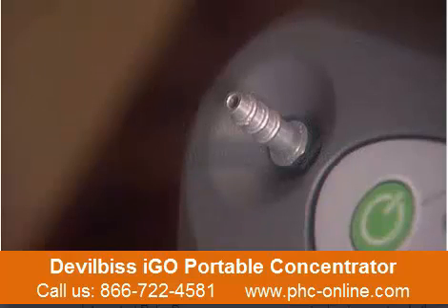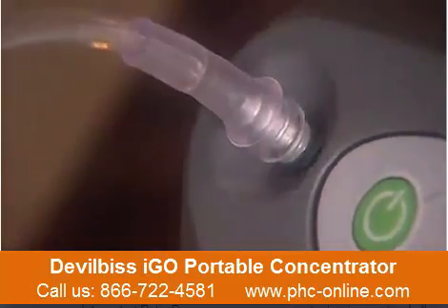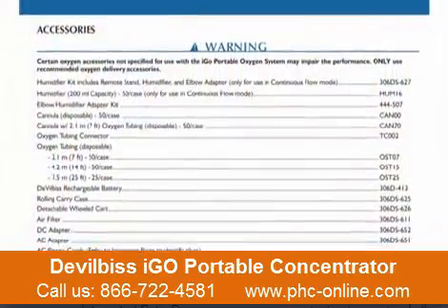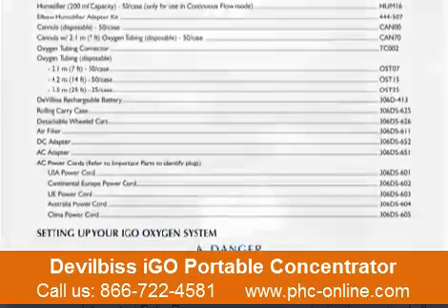To the left of the control panel is the conveniently located oxygen outlet. Simply connect your oxygen tubing to the outlet and to a nasal cannula and breathe normally. Please consult your instruction guide for a list of recommended oxygen delivery accessories.